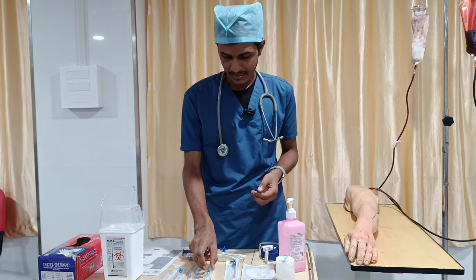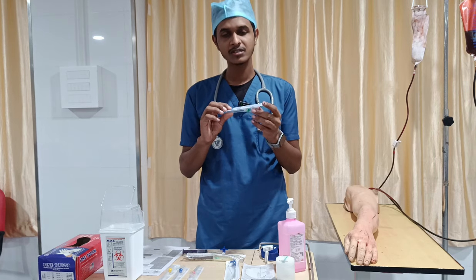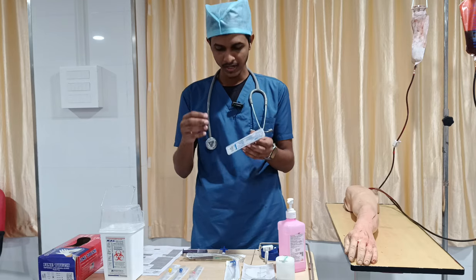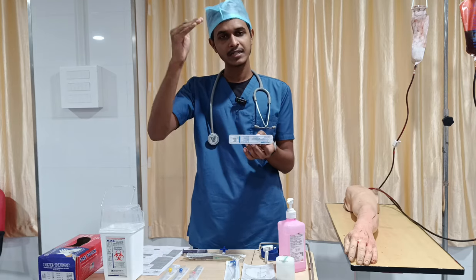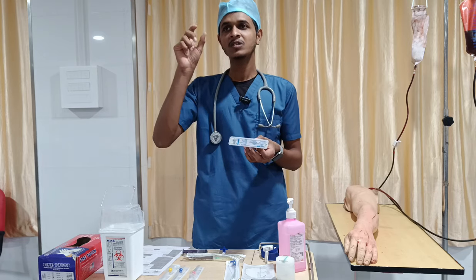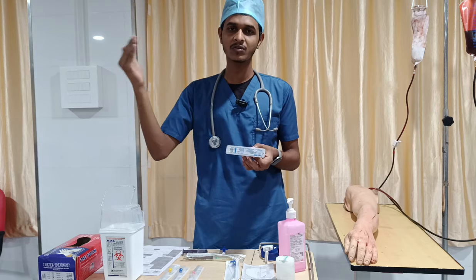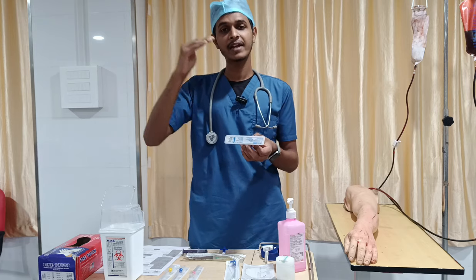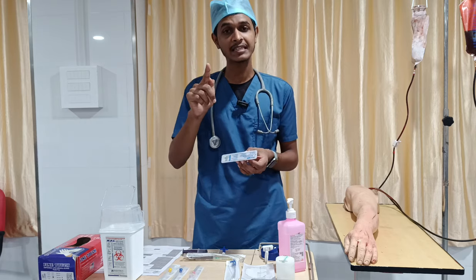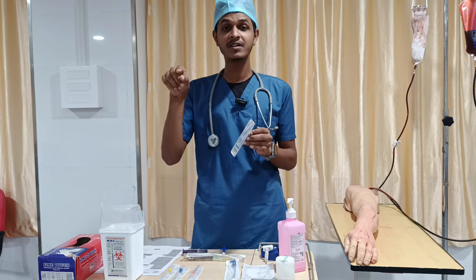So what are the major things to remember about the IV cannula? Whenever you are choosing the cannula, you should remember for what purpose you are going to introduce it. We started from 14, and 14 to 26 is the range of cannula sizes: 14, 16, 18, 20, 22, 24, 26. When the number is increasing, the diameter of the catheter and the length of the catheter will decrease. Hope you understand, that is inversely proportional.